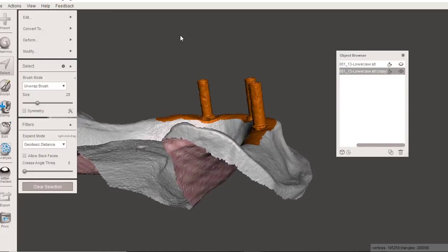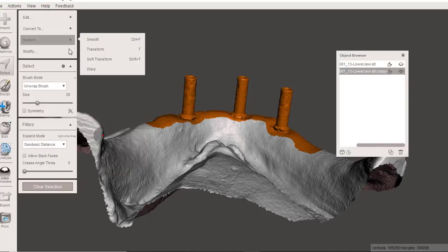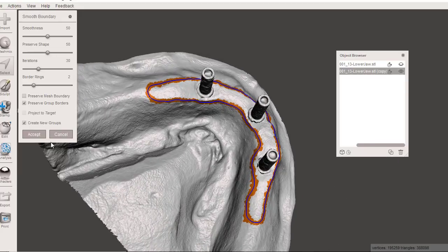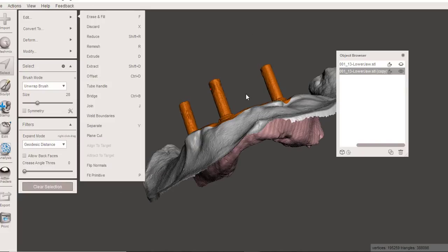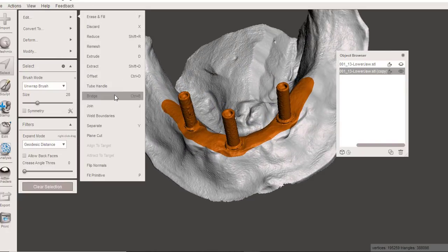Alright, and so what I'm going to do here is smooth the boundary. So come up here to modify and first optimize the boundary. That means if there's any little triangle that was left out, it'll pick that up, and then smooth the boundary. And now you can see this will give it a much more smooth contour for the next step that we're going to do.